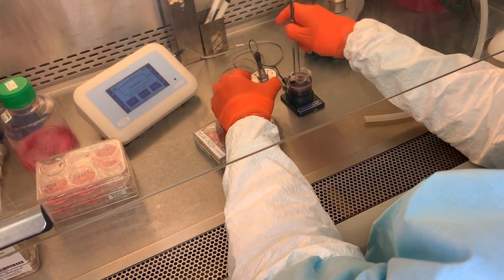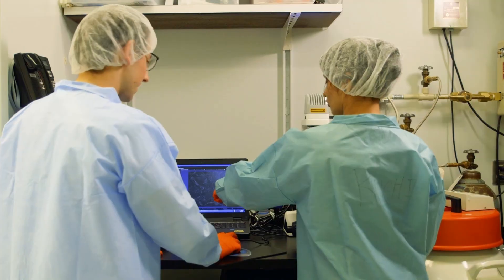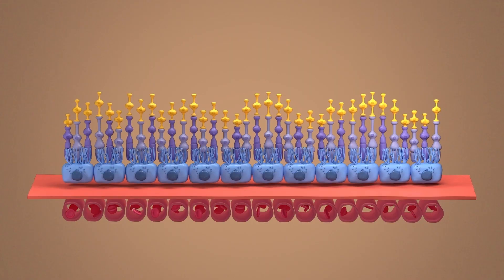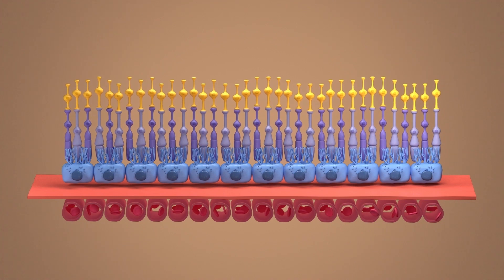We have also included the steps for freezing, thawing, and culturing back these RPE cells to get RPE tissue. The tissue derived from this protocol has been used for modeling retinal degeneration such as AMD and rare inherited diseases.